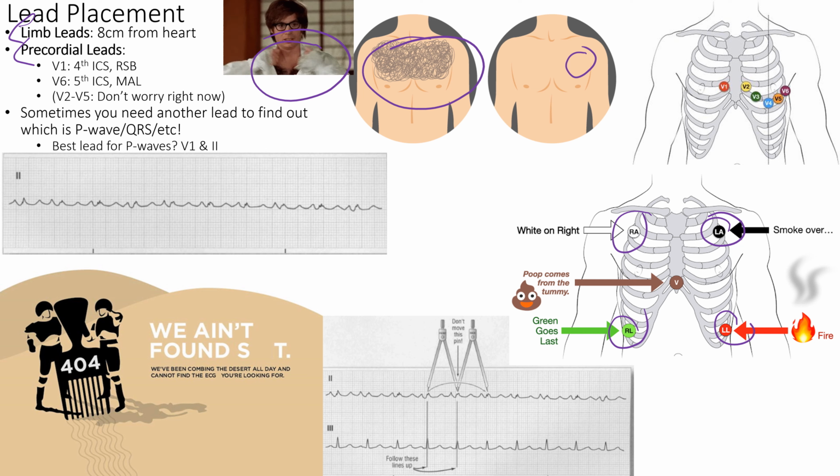It would open the skin up. It's a closer shave, and if a surveyor comes in, they're going to say, "Oh, you shaved the chest? That you're putting at risk for infection at that point." So clipping is the proper terminology there.